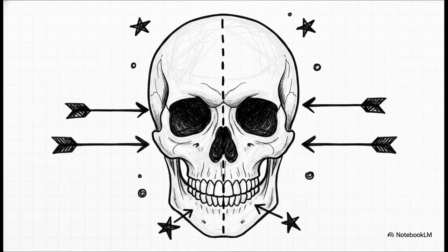Now, for the frontal reverse Caldwell and occipital Townes views, the evaluation relies entirely on perfect symmetry rather than superimposition. The image has to show equal distances from the lateral borders of the skull to the orbits or the foramen magnum. The petrous ridges must be perfectly symmetric. And hey, that mid-sagittal plane we started with, it must align precisely with the long axis of the collimated field. It's a really rigid test of spatial accuracy.